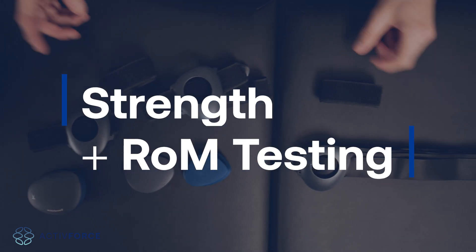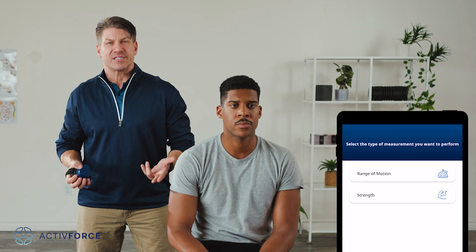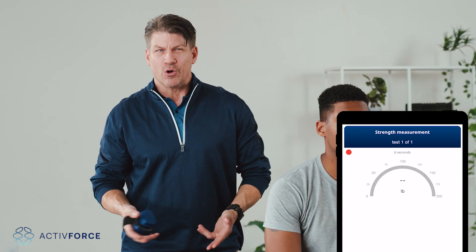Let's get into performing strength and range-of-motion tests with the ActiveForce device. To begin a strength test, open up the device app and hit the Strength Test button. It'll prompt you to choose the left or right side. Pick your side and give it a name, or hit skip if you don't want to name the test.